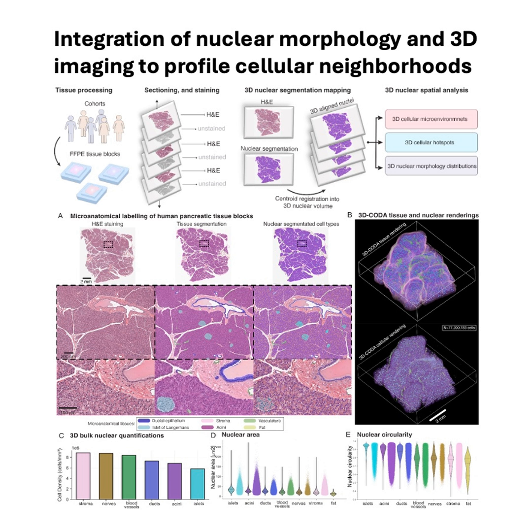Okay. And they trained it to identify a specific type of immune cell, CD45 plus leukocytes, purely based on what their nuclei looked like in the H&E images. And how well did that work? Remarkably well. The classifier achieved about 89% accuracy in identifying these immune cells just from their nuclear appearance. That's impressive. So they could map out the immune cells in 3D. What was so different compared to 2D?